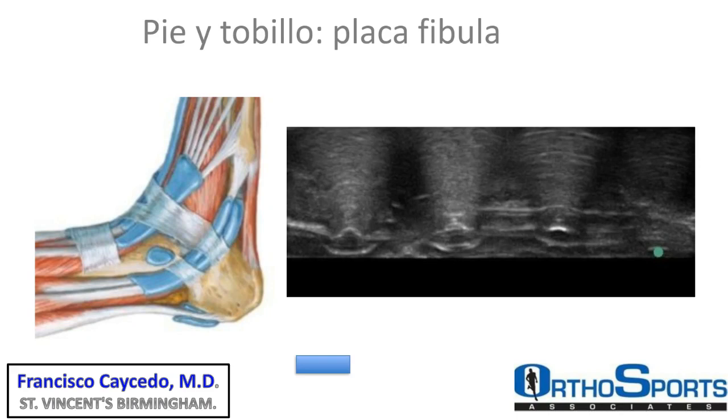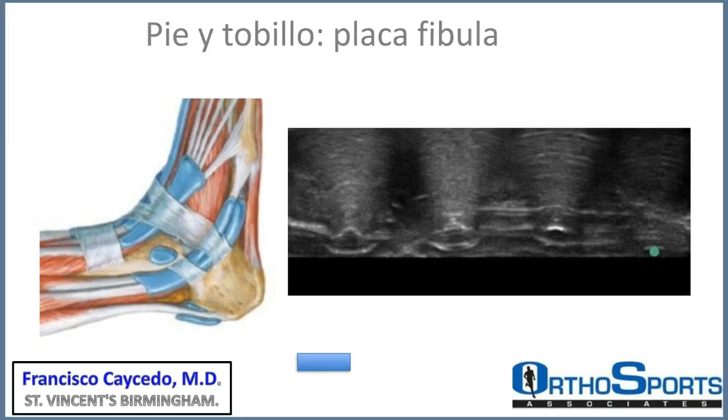And like I say, the ultrasound shows us what is under the skin. Also, the ultrasound can show artifacts or structures. You can see the head of the screws and the metal. This patient has a fracture of the fibula fixed with open reduction internal fixation, and you can see the plate. And this is the pattern that you can see when they have metal in the body.